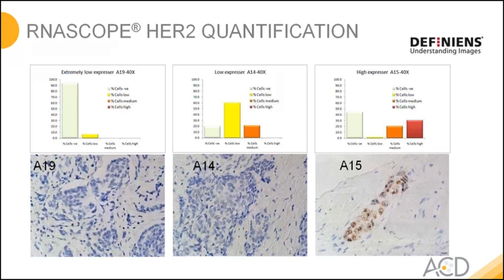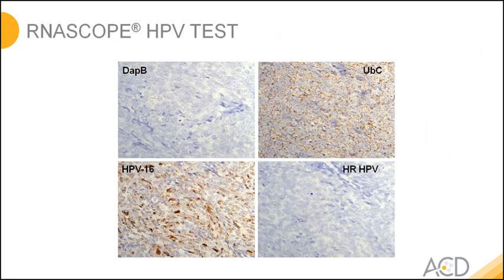And the software then also can show these results graphically, like here in HER2. The left sample is HER2 negative, so the majority of cells indeed have no transcript. The right-hand side probe is highly HER2 positive. You still find cells that have no transcript, but there is about 30% of the cells that have a high number of transcripts. So this is a nice example how the software can be used for data analysis and automating this to some extent.